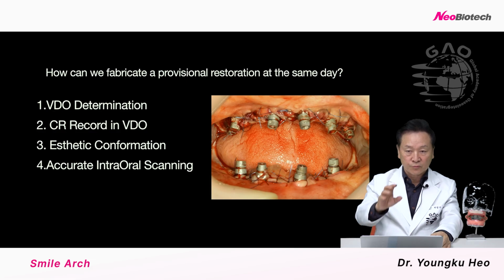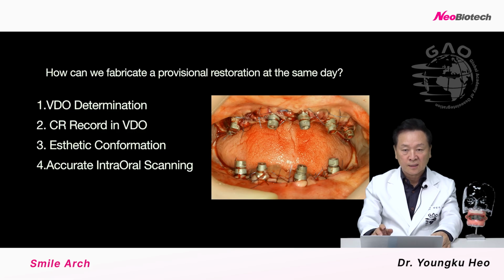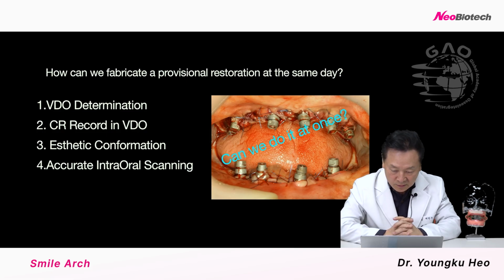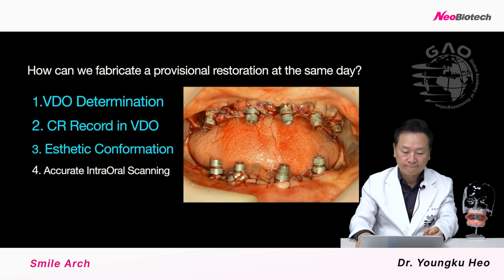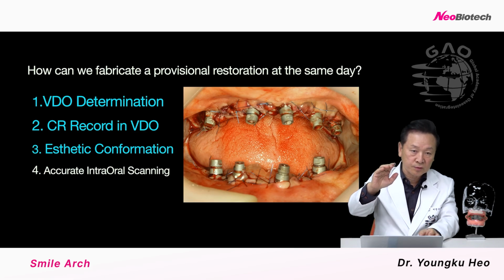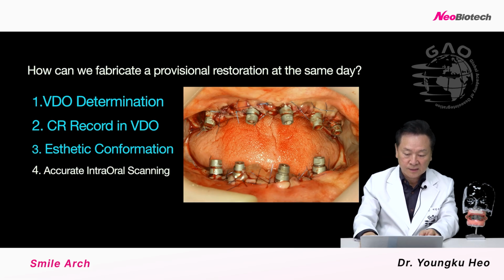After we place implants, we need accurate intraoral scanning, as you see here. But I want to get all this information on the same day to get the provisional restoration. So I'd like to talk about vertical dimension, CR record, and aesthetic confirmation at the same time.